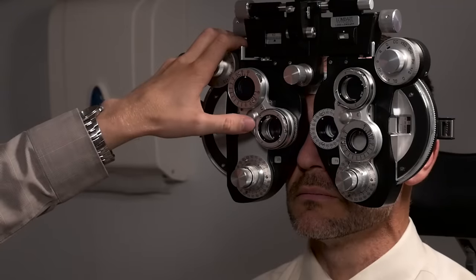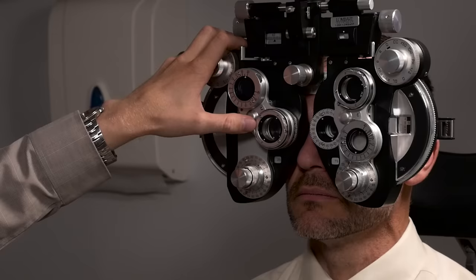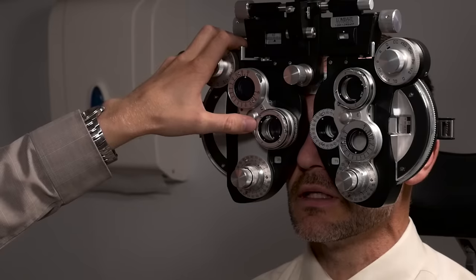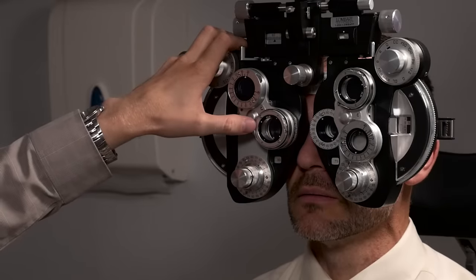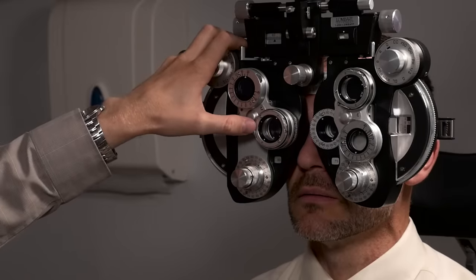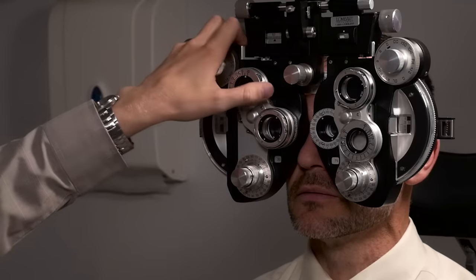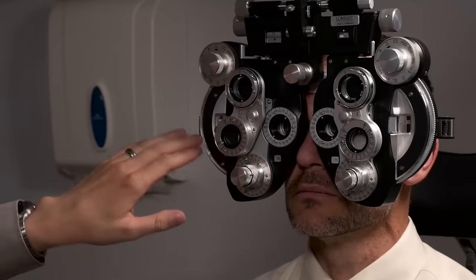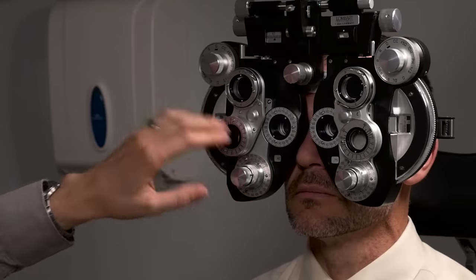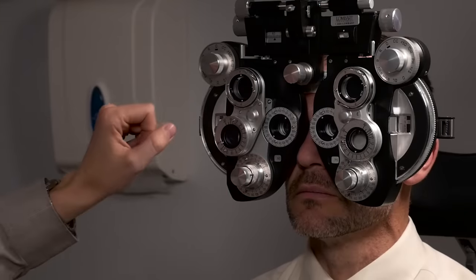So in this case since it's about the same you know that you're very close to what we need. Just to check one more time I'm going to bring this down to 0.25 cylinder and ask him again. Number one or number two? Definitely number one. And we'll do one more time. What do you like better? This is number one or number two? They're still pretty close. Okay. So at that point we've now refined the axis of the cylinder and now we've refined the degree or the power of the cylinder. So as you can tell here right now it's a negative 5.75 plus 0.50 axis 45.